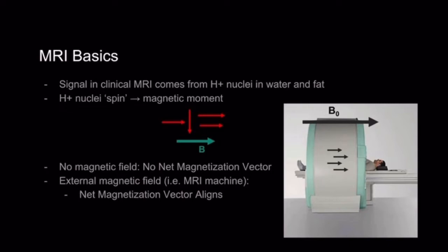When a magnetic moment is aligned in the field like we're showing here, this is considered a low energy state. Put more simply, the little bar magnets are naturally pulled in this direction along the z-axis. It's easier for them to align with the field than to oppose it. The z-axis, again, is the longitudinal direction down the bore of the magnet.